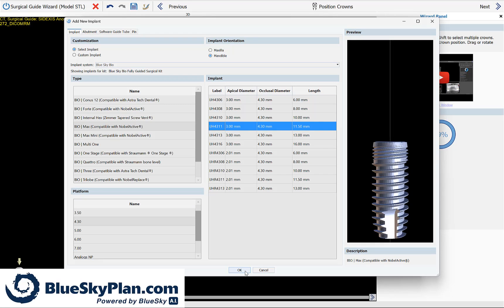Of course, you'll be able to modify the implant size later if necessary. After you've selected the relevant implant, simply click on OK.